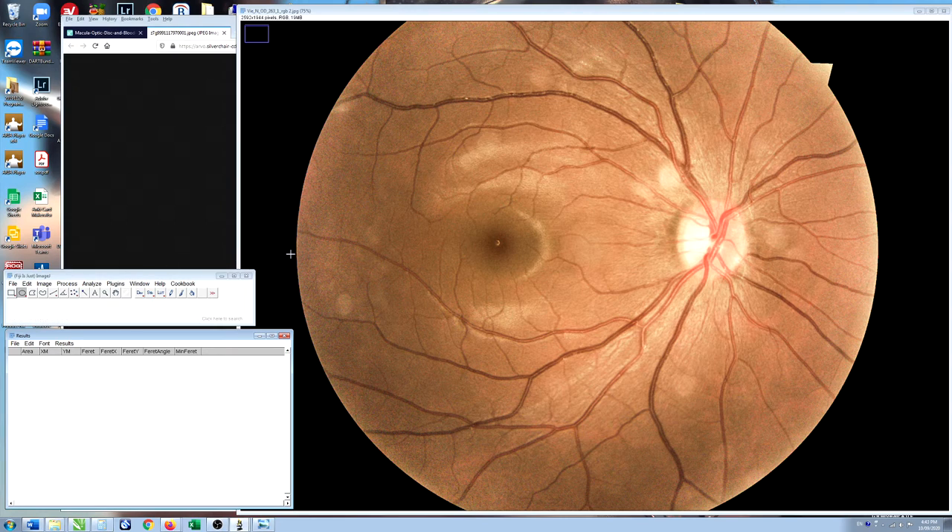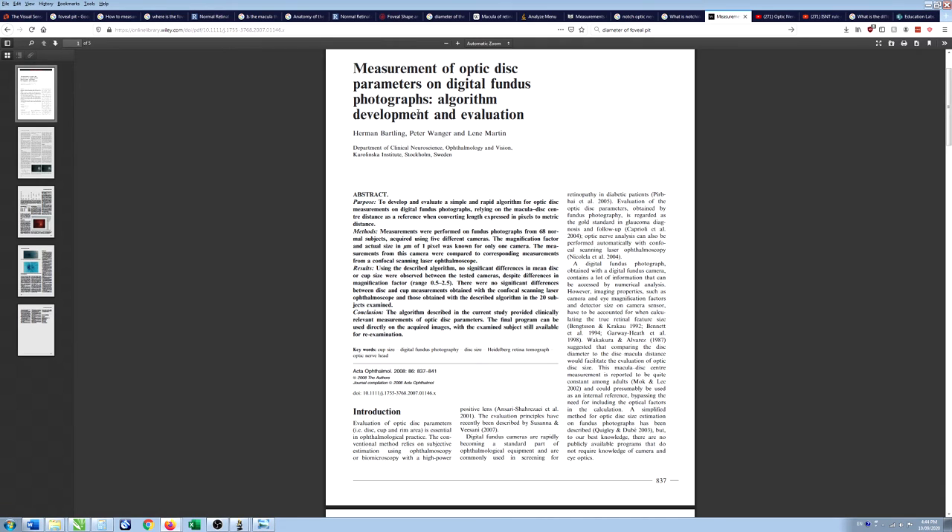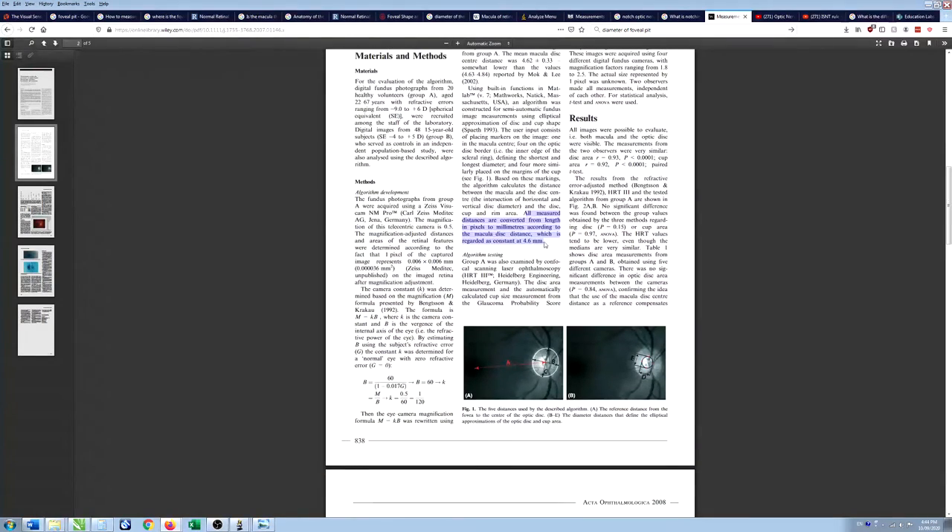The first thing we want to do is set the units in ImageJ so we're measuring in millimeters. To do that, we need a known distance on the photo. Fortunately, researchers at the Karolinska Institute have described the distance between the center of the fovea and the center of the optic disc as being 4.6 millimeters — we'll use that value to calibrate ImageJ.